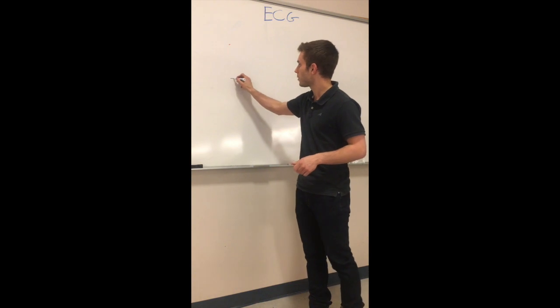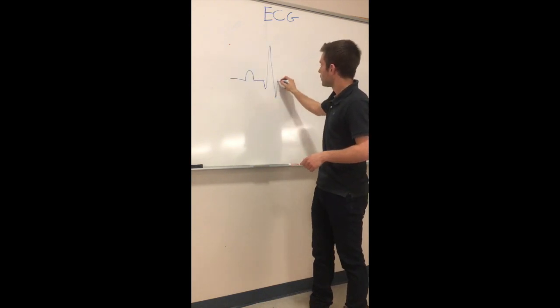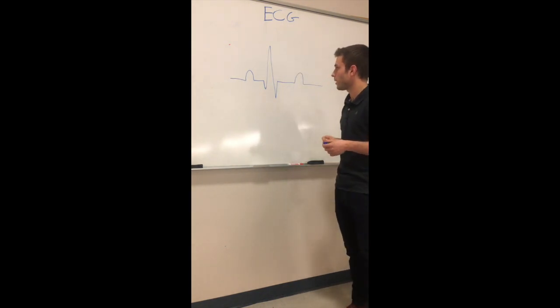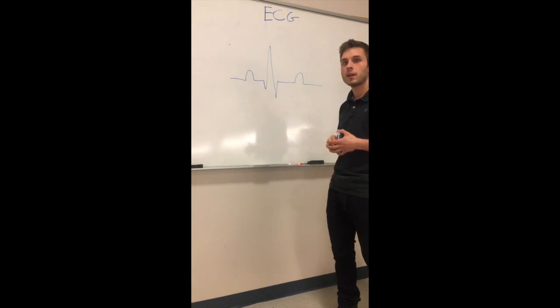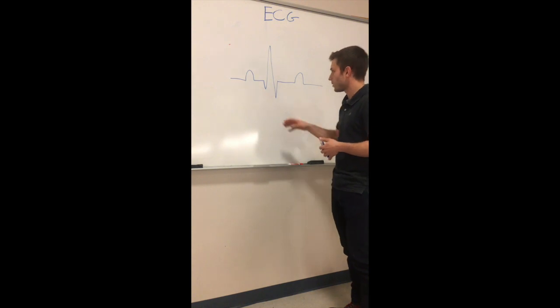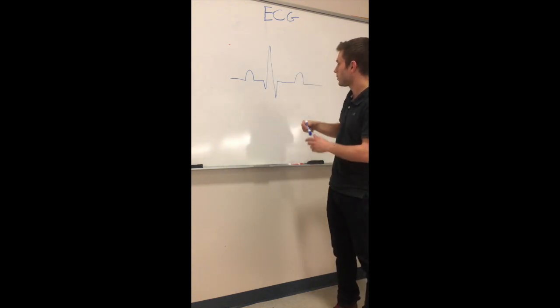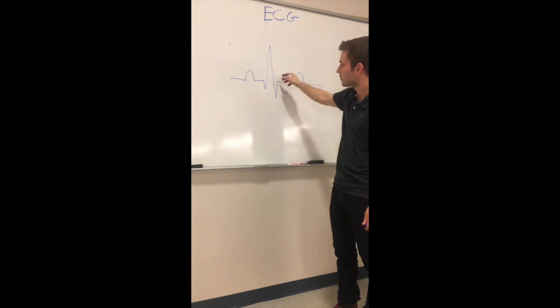And then for left ventricle hypertrophy, you'll get this trace again, and you have to calculate the height of the S wave in V1. For V1, it will actually be a negative. So again, for the QRS, you calculate this portion, let's say it's 10, but it will be lower like this.